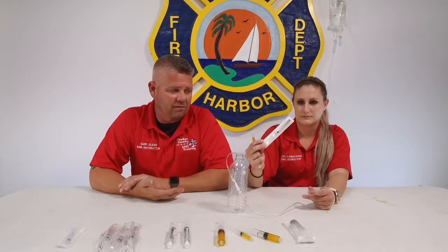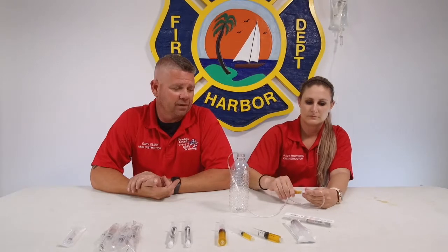So I got Caitlin here with me today. What we're going to do is show you an example of how the medication should be pushed versus what we've been hearing has been going out in the system. So what we're using here is a simple example of Zofran. We're going to give 4 milligrams of Zofran, which is 2 cc's of fluid, IV push.